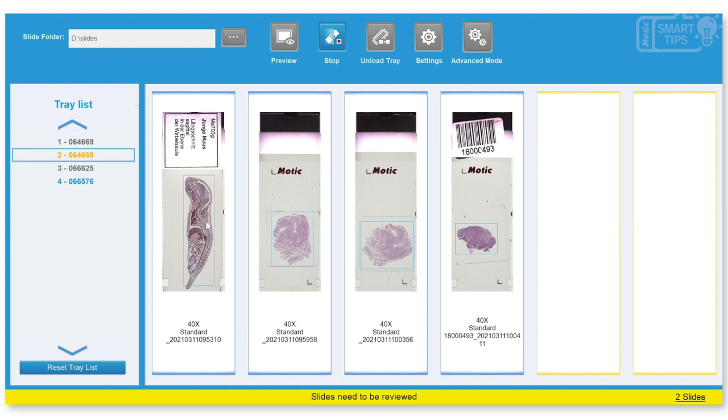But the slides 1 to 4, which are the slides that we actually filled, are properly scanned. You can see them here.